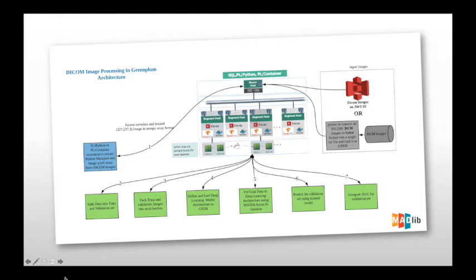After you do the train and validation set splitting, you take the train and validation images, and pack and distribute them into segment servers. So let's say, as we discussed in the beginning, there are four segment servers, and you only have GPUs attached to two segment servers. In that case we want to put the images only onto those two segment servers that have GPUs connected to them.